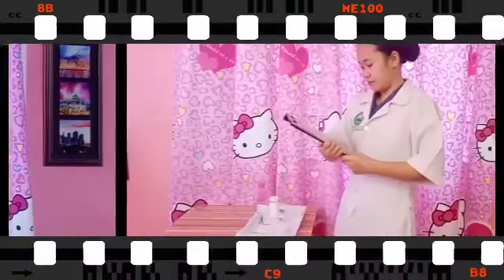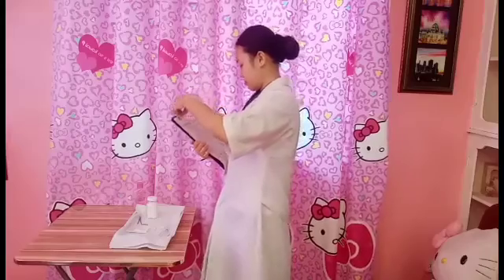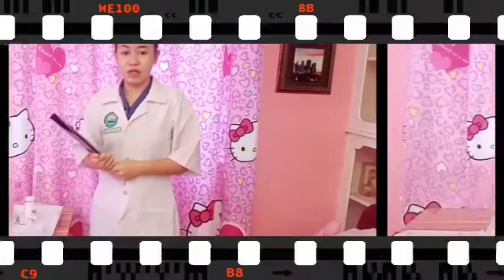Third is to check the MAR, or the medication administration record. Check the labels on the medication carefully against the MAR to make sure that the correct medication is being prepared. You need to follow 3 checks: first, when it is taken from the medication cart; second, before withdrawing the medication; and third, after withdrawing the medication. This is to ensure that the correct medication is administered to the correct patient.